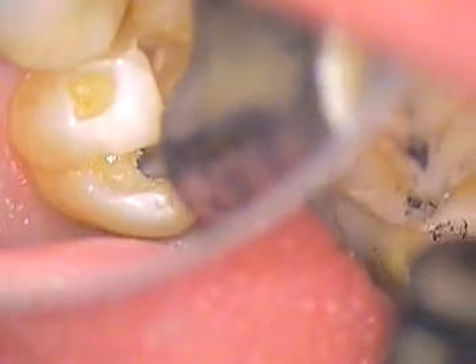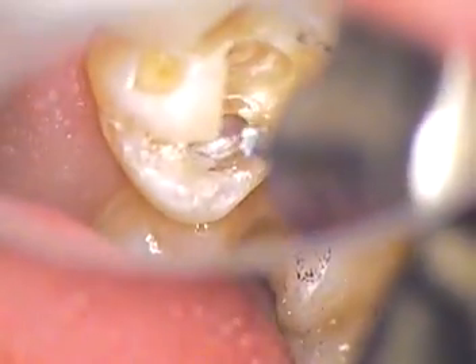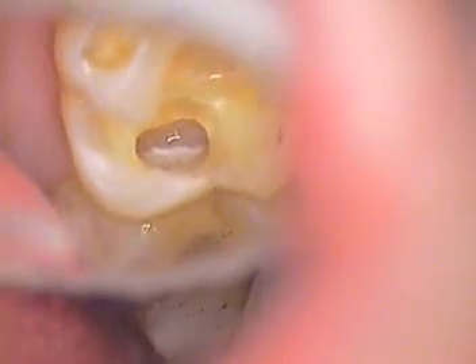It looks like we may need a longer shank burr. If I open this up a little bit more — we're going to switch now to a longer shank burr and continue to clean that out. We have a long slow-speed round burr. Longer if you've got it — surgical length. Let me go to a long chamfer burr.